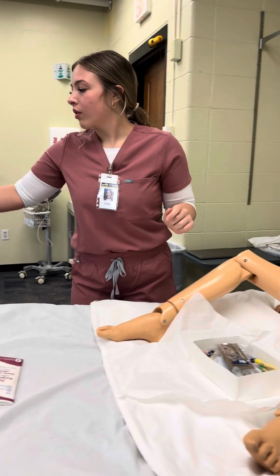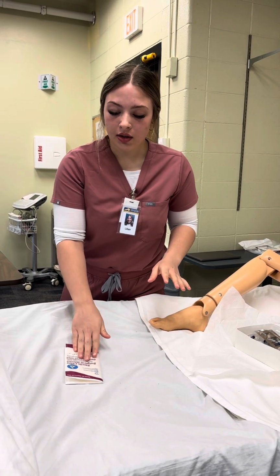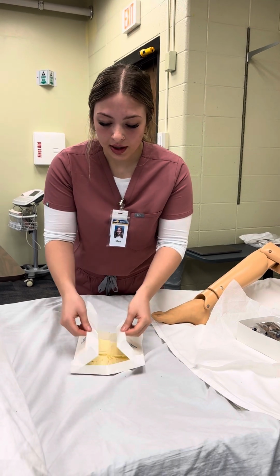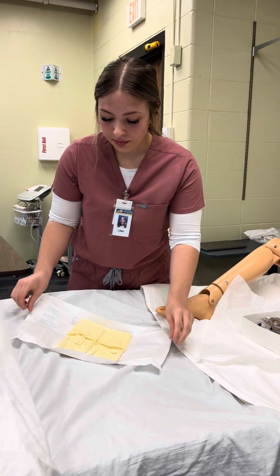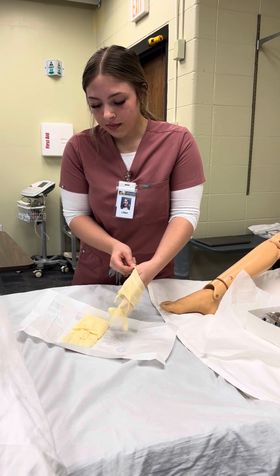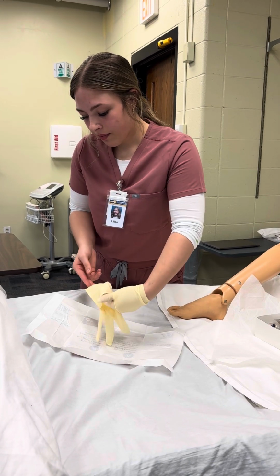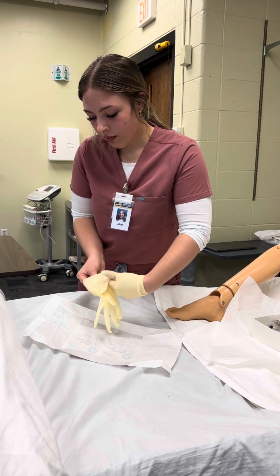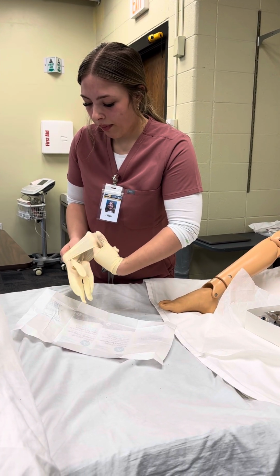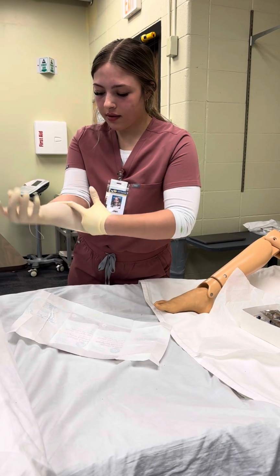Okay, and then I would perform hand hygiene once more and go ahead and put on my sterile gloves, and I'd be sure that the packaging is intact, dry, and not expired. So I'm going to go ahead and put on my gloves. Going to put my non-dominant hand on first, and then my dominant. And then I would adjust the cuffs.